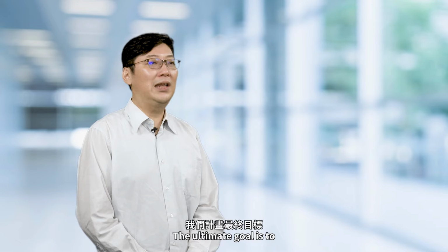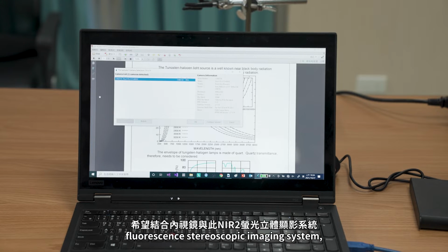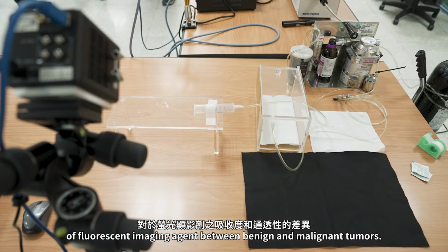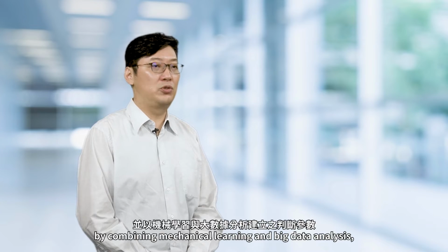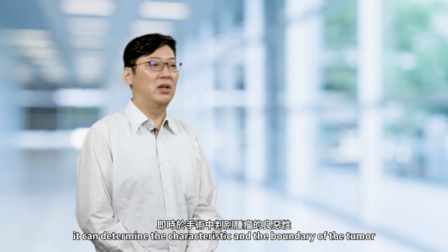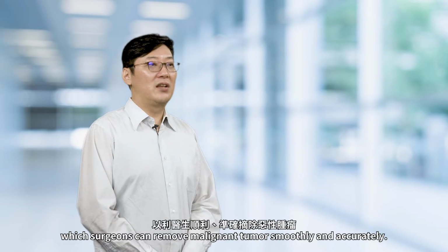The ultimate goal is to combine an endoscope with a near-2 fluorescence stereoscopic imaging system through the differences in absorption and permeability of fluorescent imaging agents between benign and malignant tumors. The image can be presented instantly during operation through the endoscope lens. By combining machine learning and big data analysis, it can determine the characteristics and boundary of the tumor, so surgeons can remove malignant tumors smoothly and accurately.